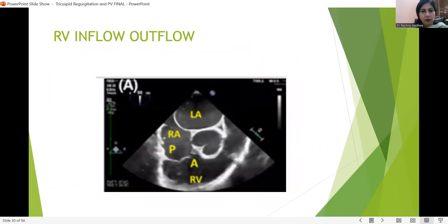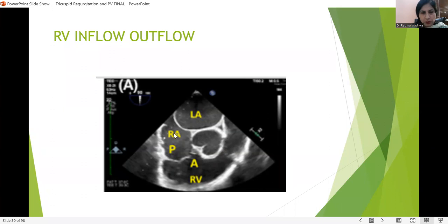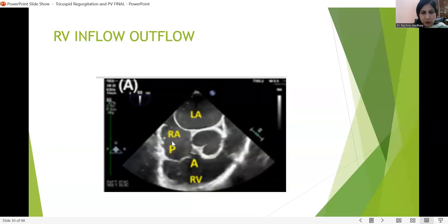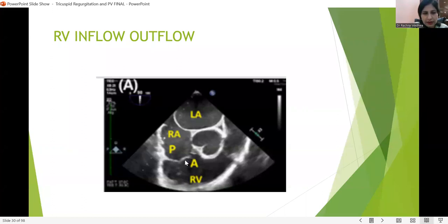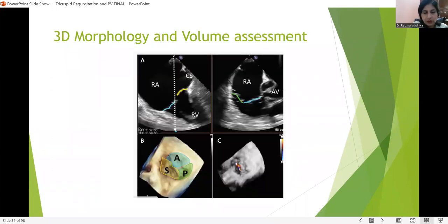This is the RV inflow-outflow view, where we can beautifully see the interatrial septum, the aortic valve, the tricuspid valve, and the pulmonary valve. This is also known as the wraparound view — because if we put a PA catheter, it travels from here to here along this path. This view helps in knowing the position of the Swan-Ganz catheter. In this view, this can be the anterior or septal cusp, and this is the posterior cusp of the tricuspid valve.